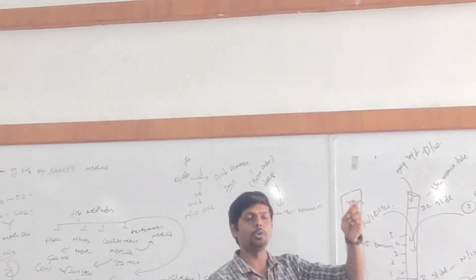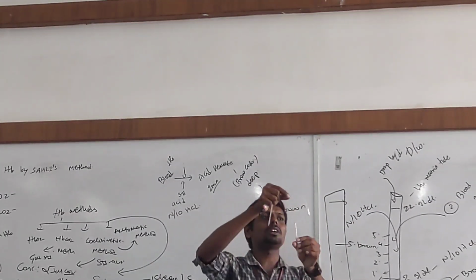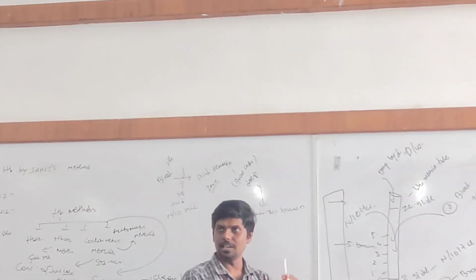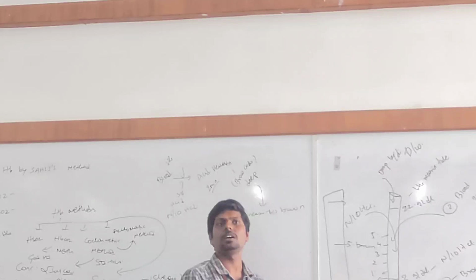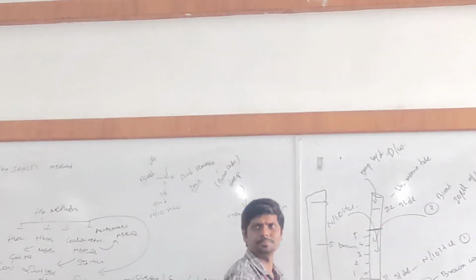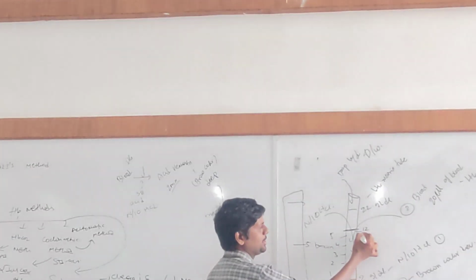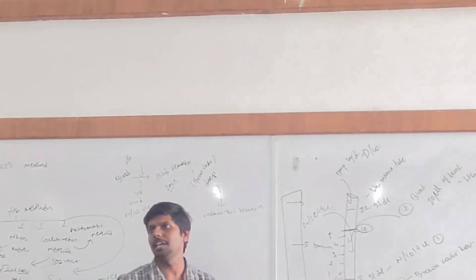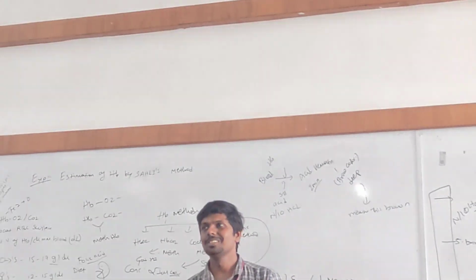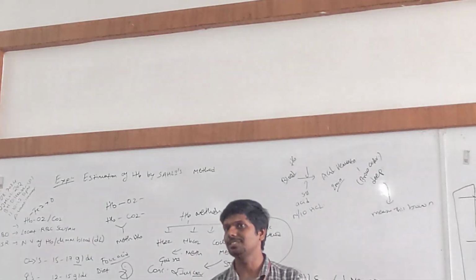So you have mixed it, then you will check the comparator color. If it is still too dark, you will add water again. You will add water until this color matches this color. The color of the test tube will match the color of the comparator. Once the color matches, you take the reading. If this reading was 12, that will be your HB content. Simple. So that's it. This is how we can perform HB estimation.